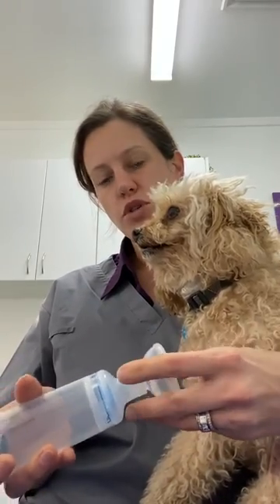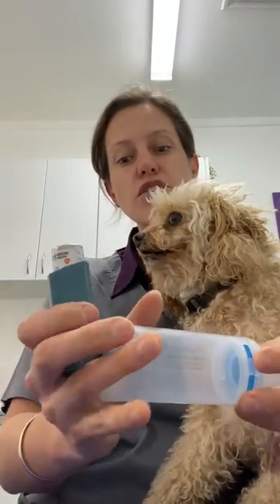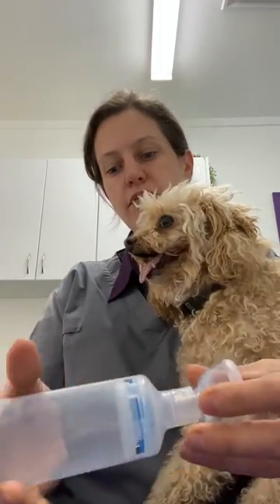What you would do is attach your Ventolin, give it a little shake, and attach your Ventolin to the end of the spacer — there's a nice little fitting that it slots into.